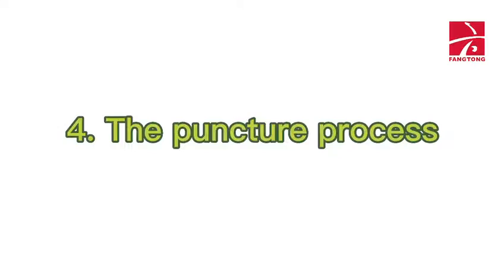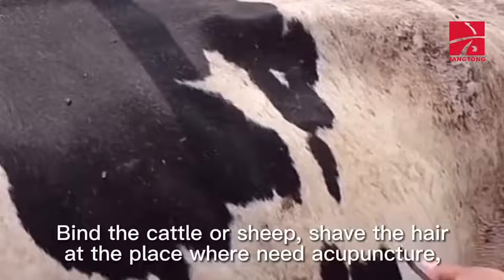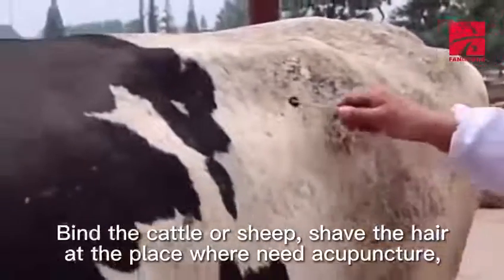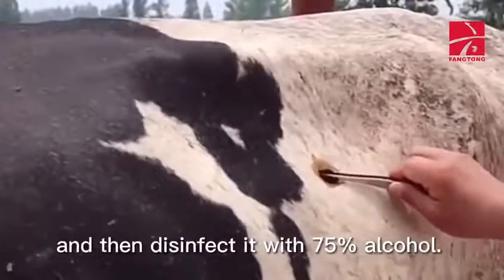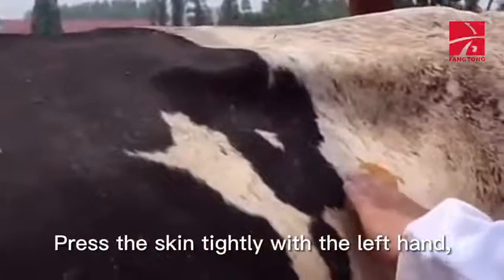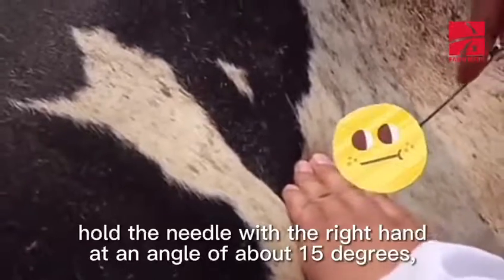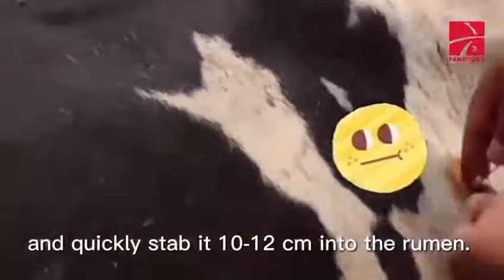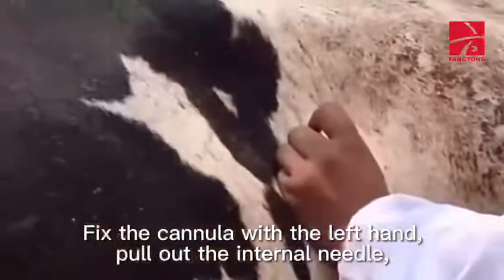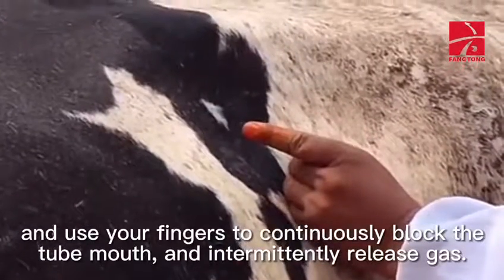Fourth, the puncture process: bind the cattle or sheep. Shave the hair at the place where acupuncture is needed, then disinfect it with 75% alcohol. Press the skin tightly with the left hand. Hold the needle with the right hand at an angle of about 15 degrees and quickly stab 10 to 12 centimeters into the rumen. Fix the cannula with the left hand, pull out the internal needle, and use your fingers to continuously block the tube mouth and intermittently release gas.